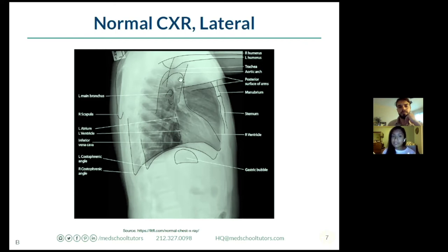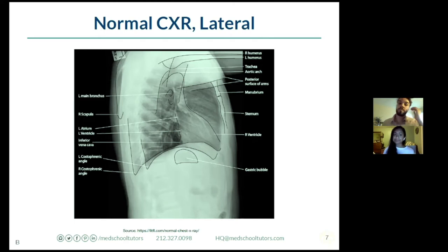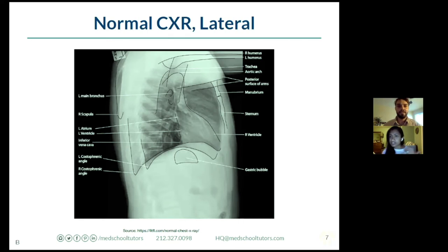The big things you're looking for on a lateral include the spine sign. The spine - vertebral bodies are quite white up high, then lighter and more transparent as you go down; here you can see much more black, and that's the normal pattern. You can see it become more lucent as you move down because you don't have as many overlying vascular and mediastinal structures. If you see it's whiter rather than darker, that suggests a consolidation or some process that shouldn't be there - whether pneumonia or mass. That's a key finding they'll show on laterals for the USMLE - the lower lobe pneumonia sign.